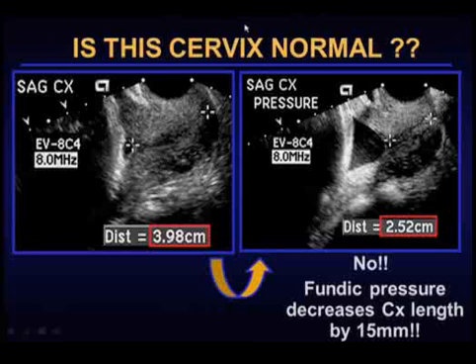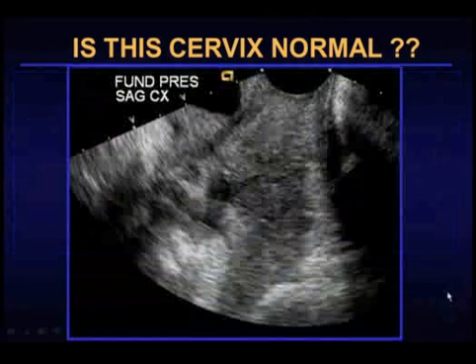That's analogous to if a woman, again, if she's having a contraction, then physiologically she's putting pressure against that internal os, which is why, as I've already said, at the time of a contraction, go and look at the cervix because it might be getting shorter. If she's not actively having contractions, but you're concerned, see if you can put pressure against it by putting pressure on the fundus and pushing down in the direction of the internal cervical os.